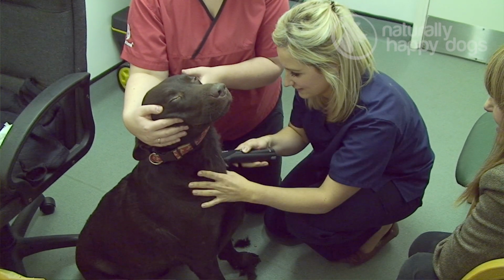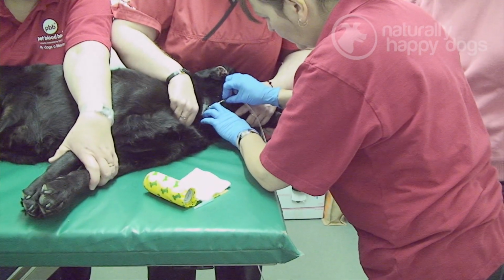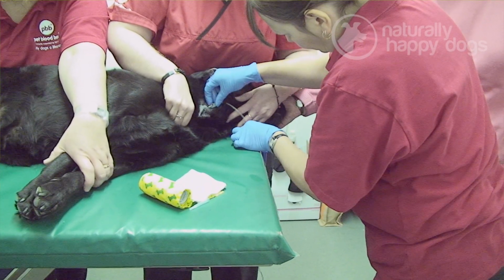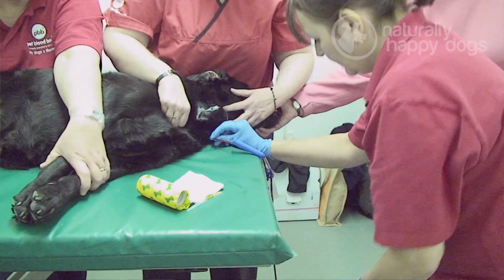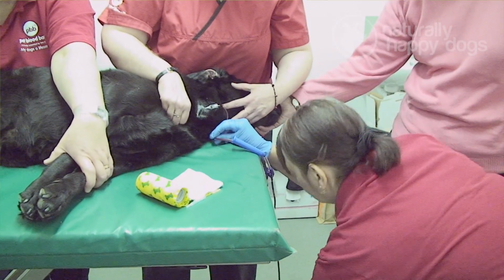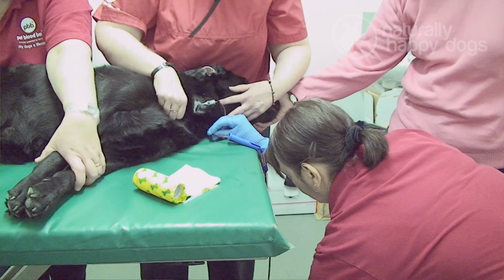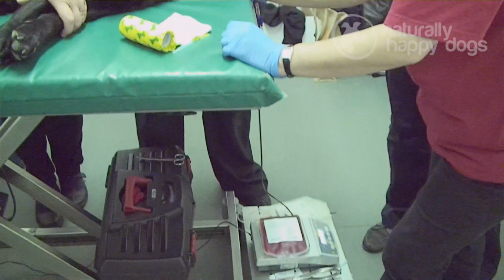The blood collection itself takes about 5 to 7 minutes, and your dogs will be reassured throughout that process to make sure that they are enjoying the experience. Most dogs completely relax on the table, very much enjoy what's happening to them, and some of them even fall asleep, especially after they've donated a few times. They know what's going to happen and nod off as we're actually collecting the blood.